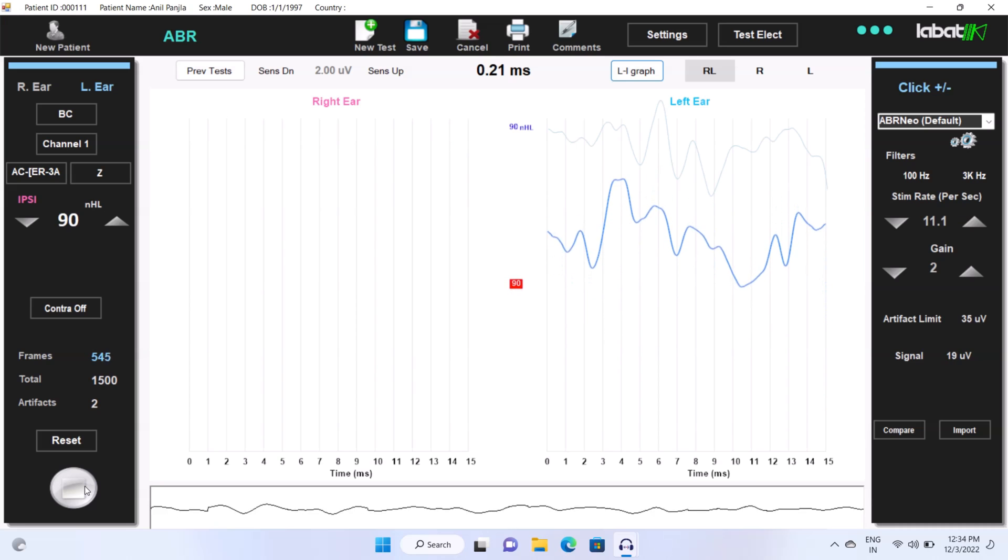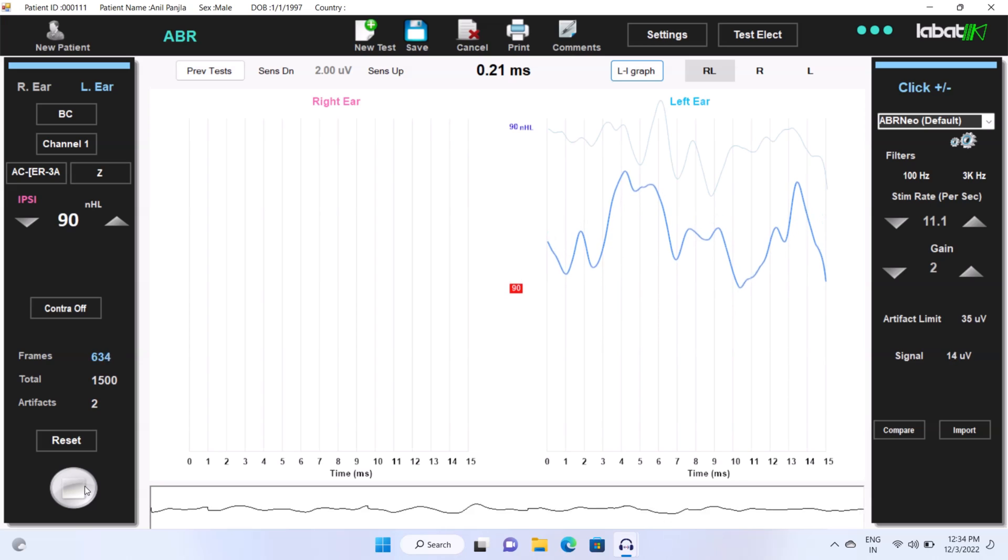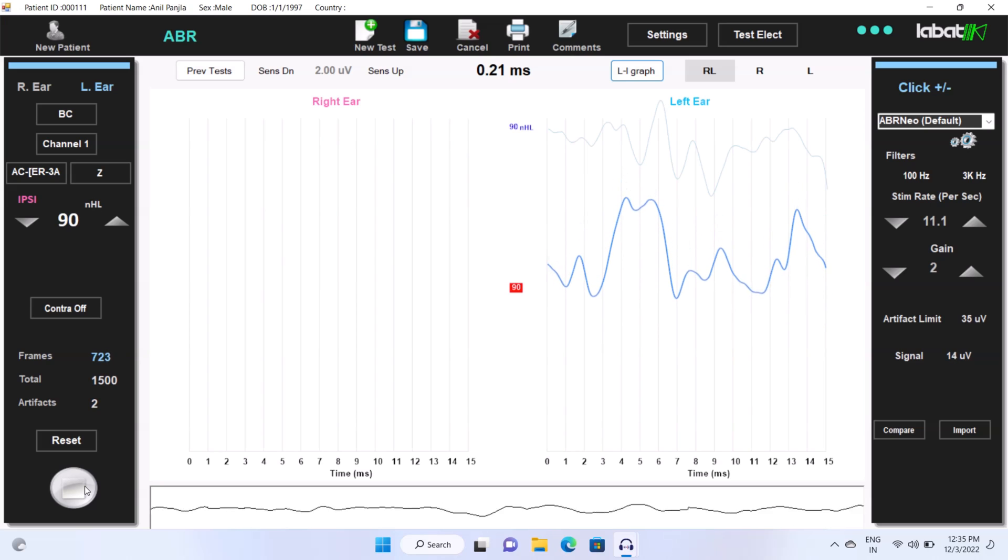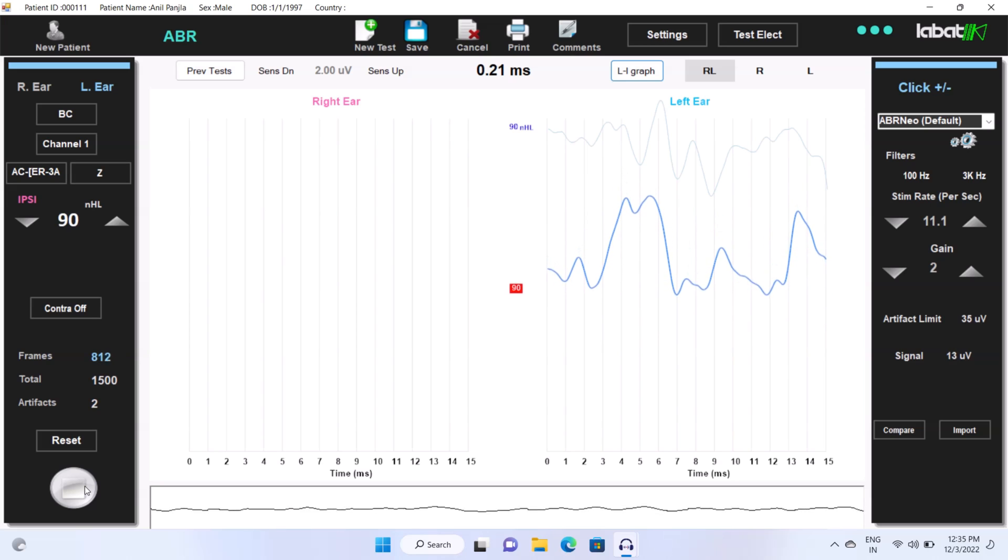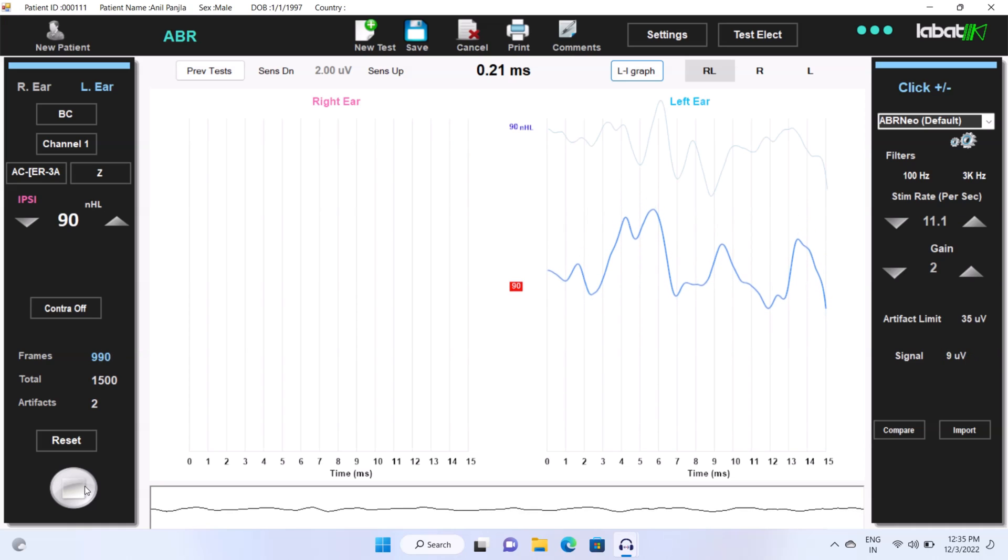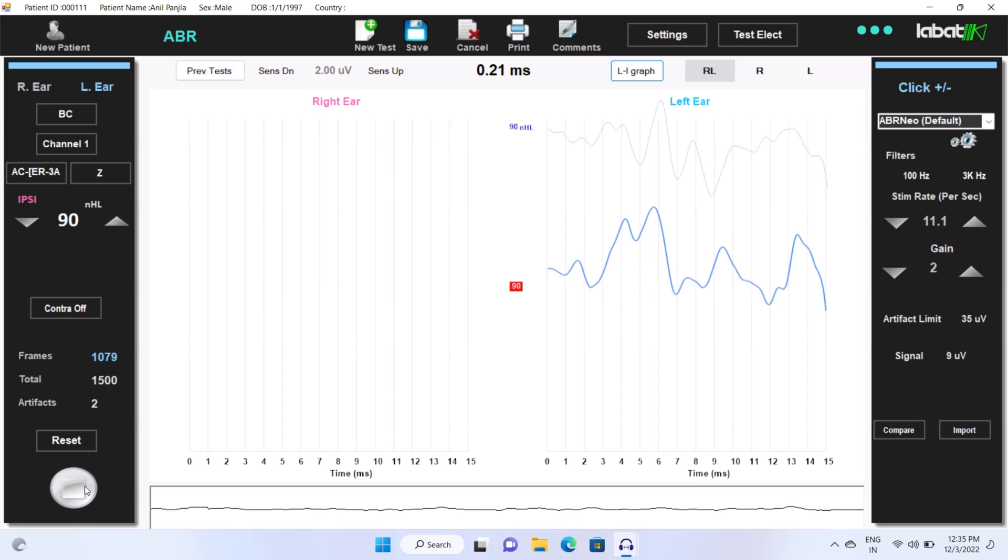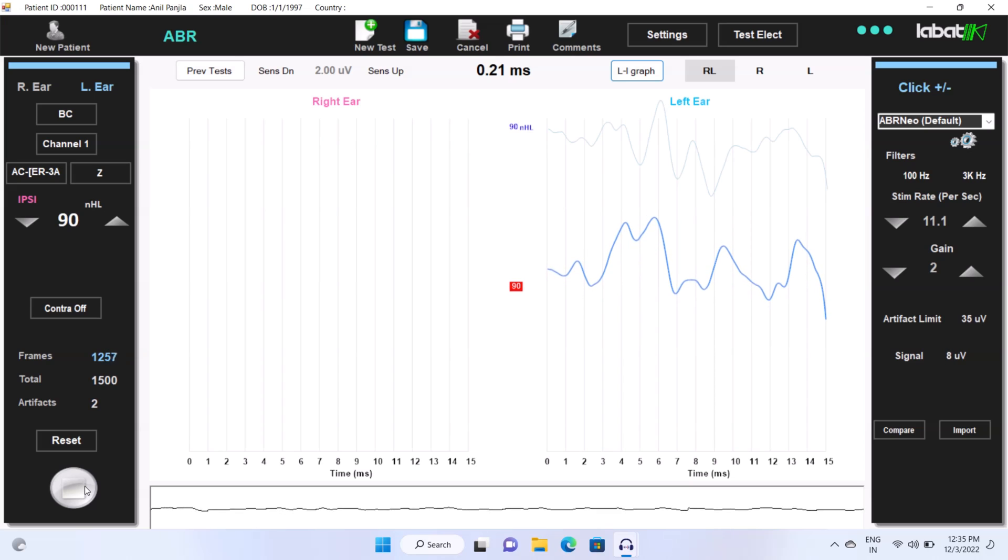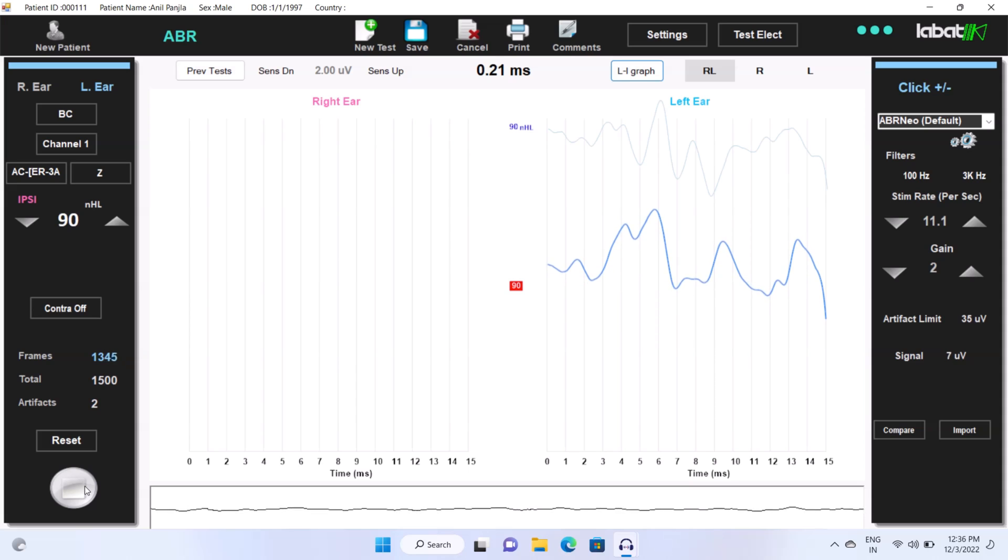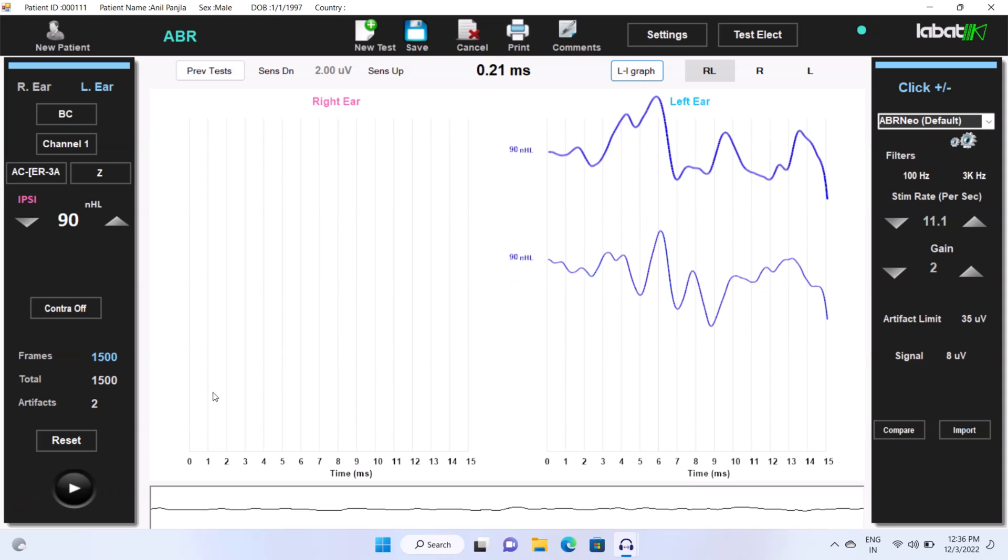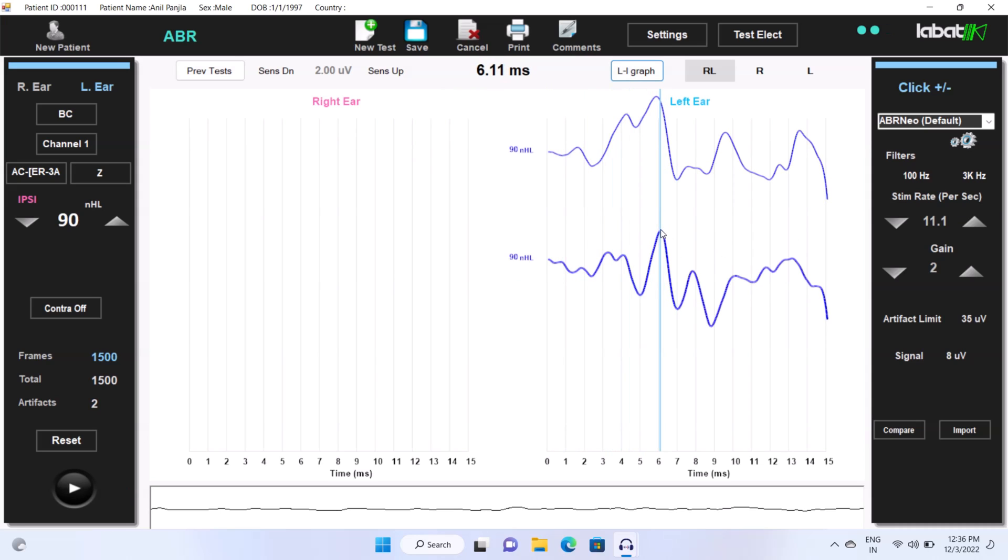You can change the stim rate, gain, bone conduction, or several filters. As you see, we get artifacts but the result is almost same. This shows the accuracy of LABOT BERA.